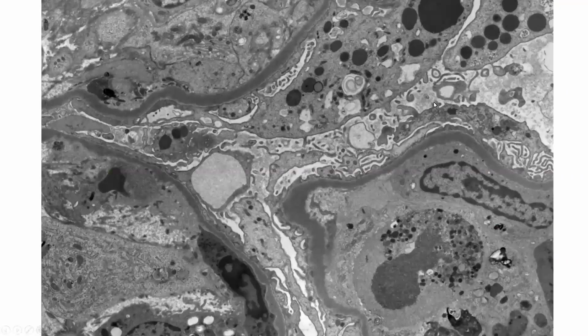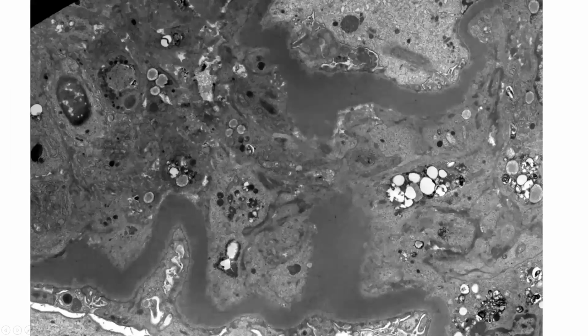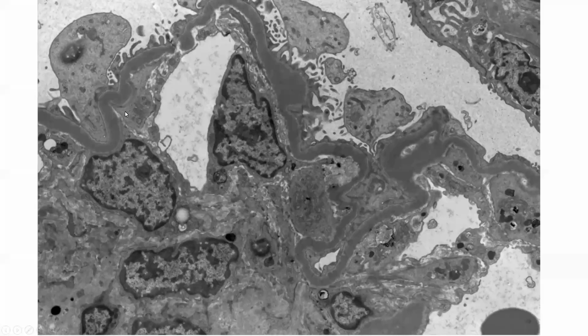Electron microscopy was remarkable for a diffuse alteration of the glomerular basement membrane, where it was variably thickened, in some places markedly so, in others less so, by quite electron-dense material with extensive effacement of overlying foot processes. And you can see that electron-dense material continued along the basement membrane as it laid over the mesangium, as well as out in the capillary loops.